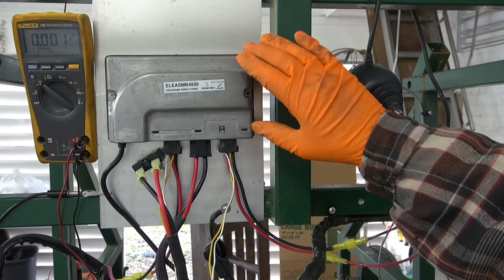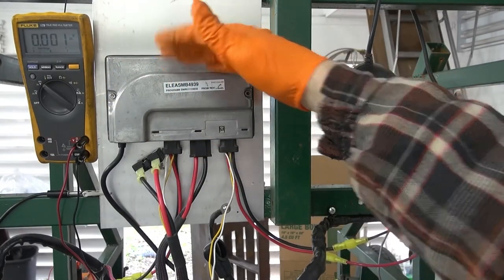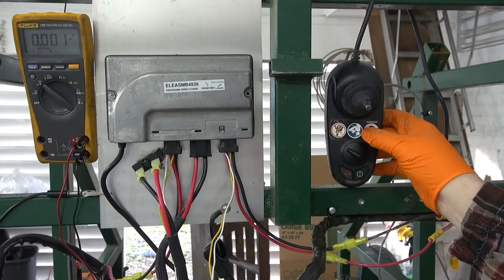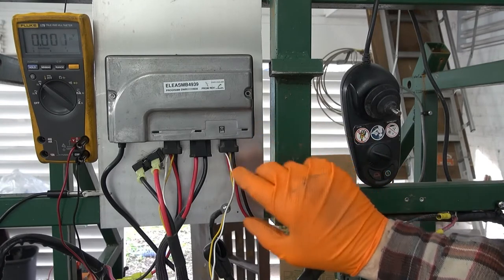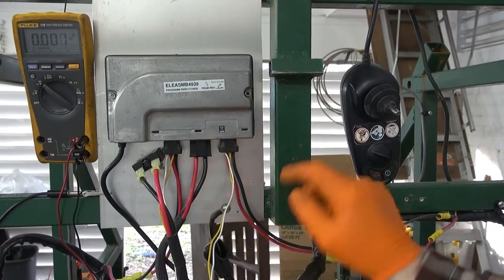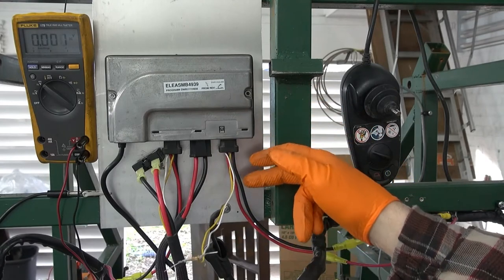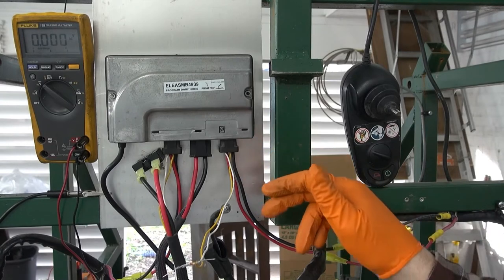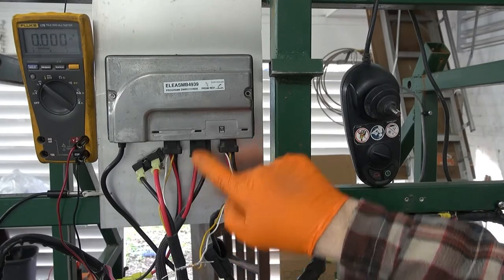If you're working with a power wheelchair or power chair and you have a motor controller that looks like this — maybe from a Jazzy — and this is the remote control. On this controller, these connectors are for the motors: the right motor and the left motor. The white and yellow wires are for the electric brakes, and the red and black wires are the DC drive motor voltages for forward and reverse control. In the center is the 24-volt DC power input.